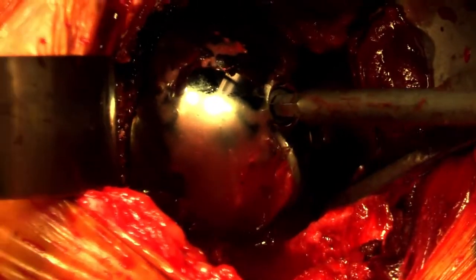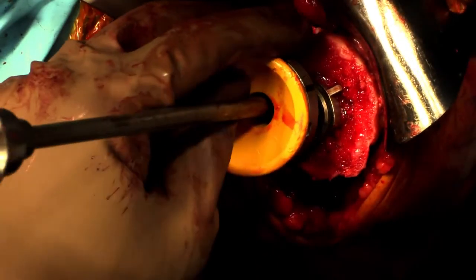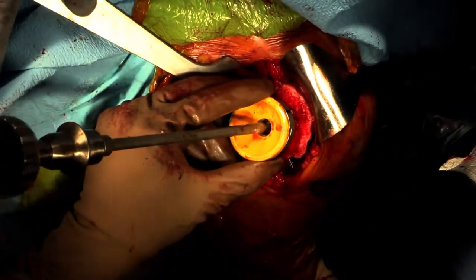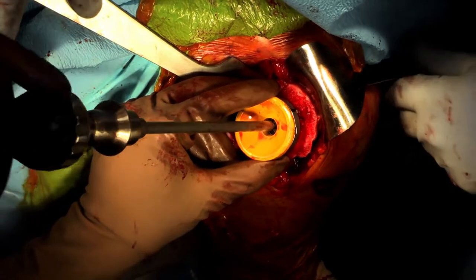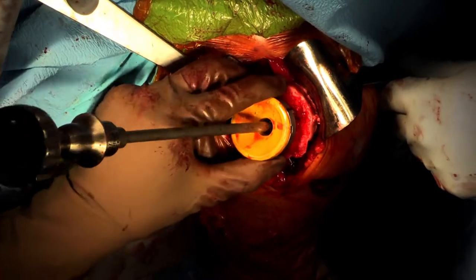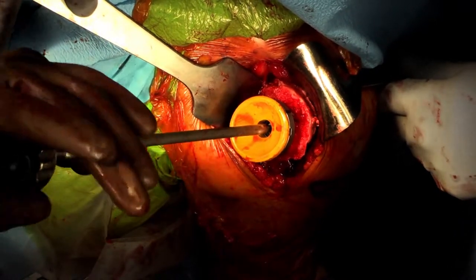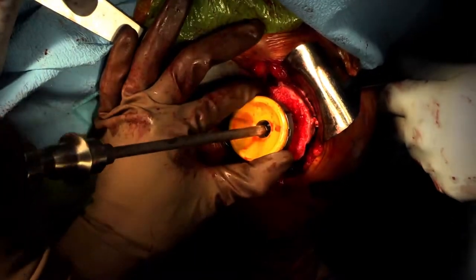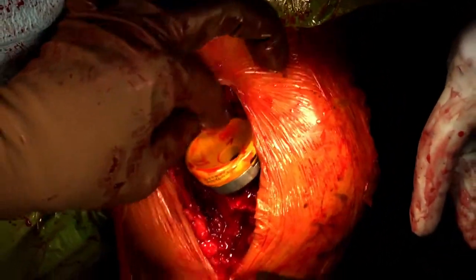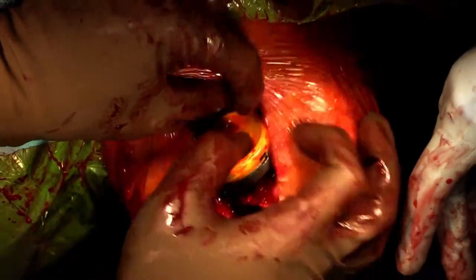Proceed to humeral trialing. The humeral liner and tray is snapped together and can be inserted in one piece. Insert the humeral tray, making sure the laser line is lined up with the lateral fin. Internally rotate, plus axial traction, to relocate for trialing.